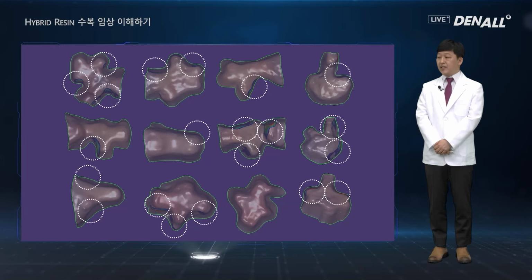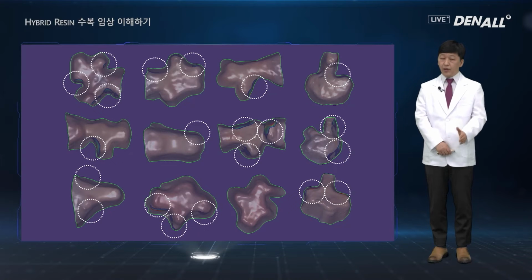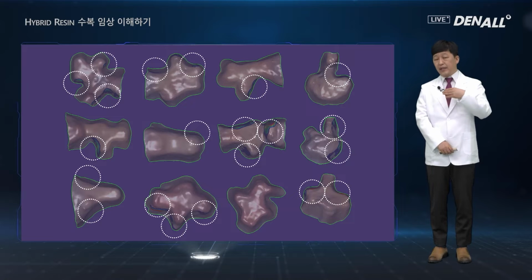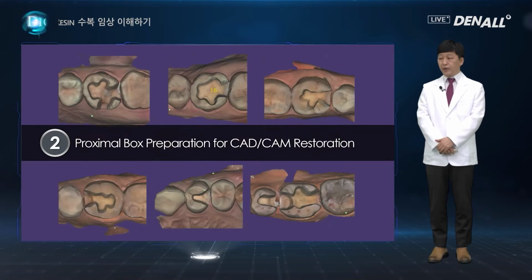As shown, after you prep, the red bit is undercut. As in the analog method, if you do not relieve this undercut and just go ahead and print it out, the restoration will not have a good fit. Before doing final rendering, you need to adjust the prep to remove the undercut. If there's undercut, the fit of restoration will go down.